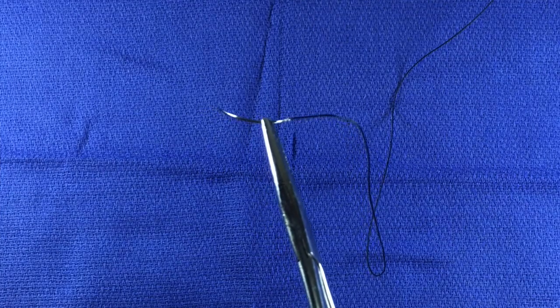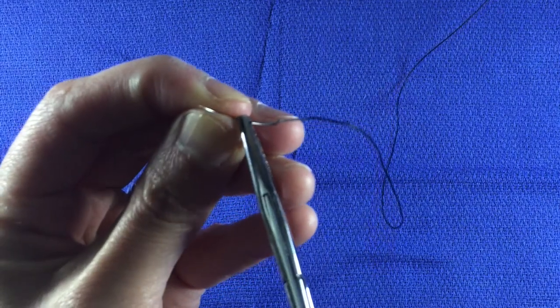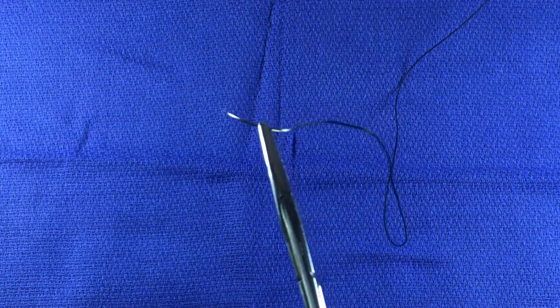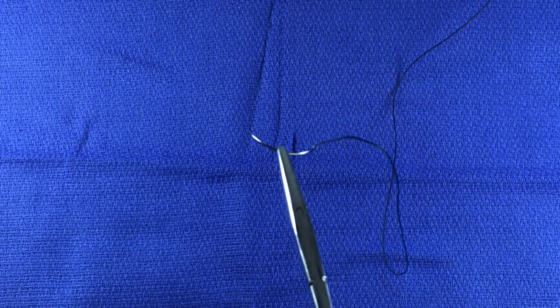Sometimes, you may be instructed to choke up on the needle. That just means to grasp the needle closer to the tip. This is particularly useful if you need to take a small bite and travel only a short distance.